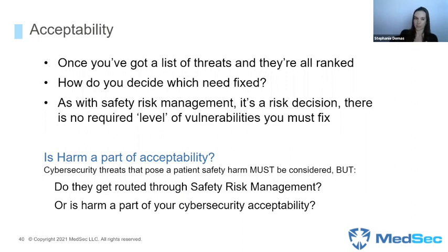It's risk management based. So the biggest decision you will have to make as a company is whether or not harm is part of your acceptability. And this one always gets a lot of weird looks when I first propose this to people, because from a safety risk management perspective, they're so accustomed that everything traces back to harm. And actually my recommended approach is security does not.